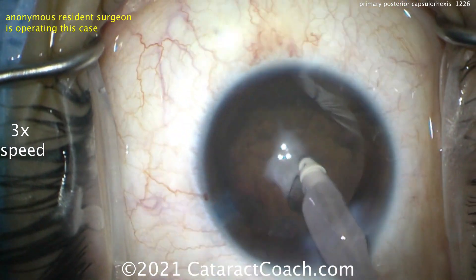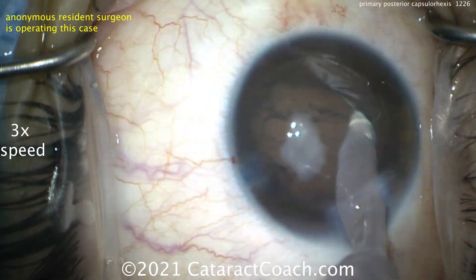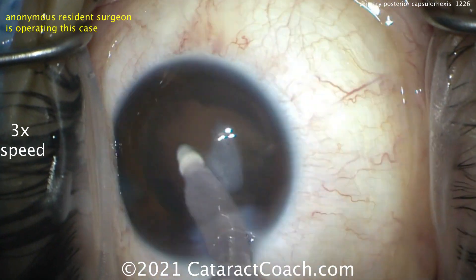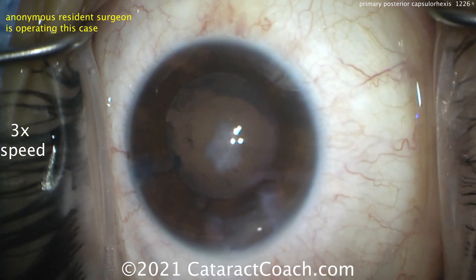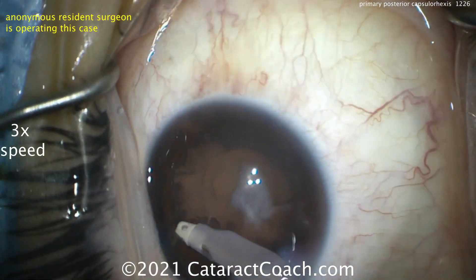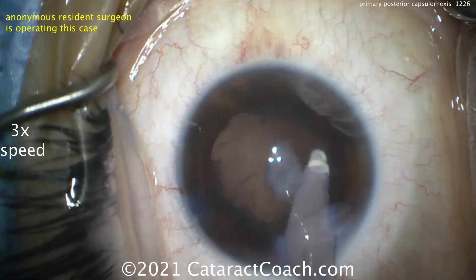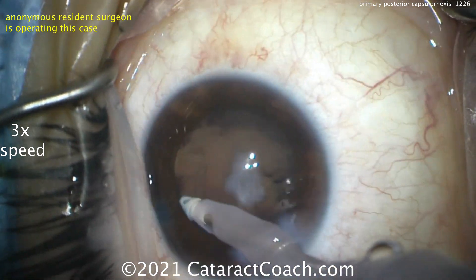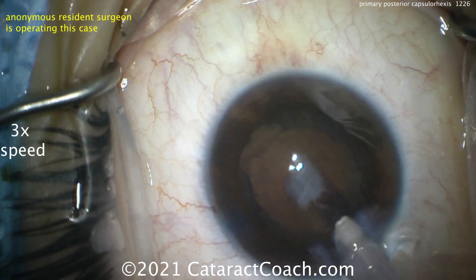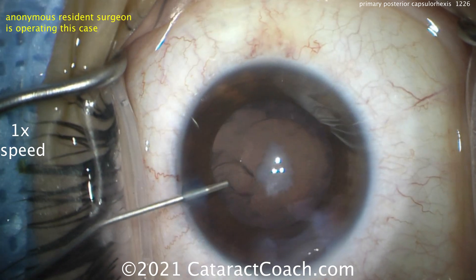We're going to show you that. At the end of this case, we'll do an OCT image and show you real-time OCT so you'll be able to see the anatomy very well. Cleaning up our capsular bag here — there's that big central plaque. You can sometimes peel it off, but you don't want an irregular tear in the posterior capsule. We want to put a single-piece acrylic lens in the capsular bag, and that's going to be our best option.